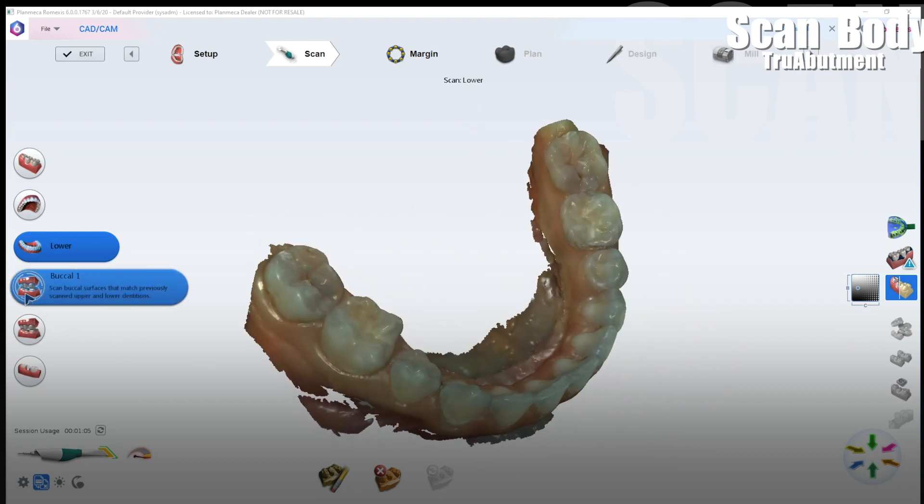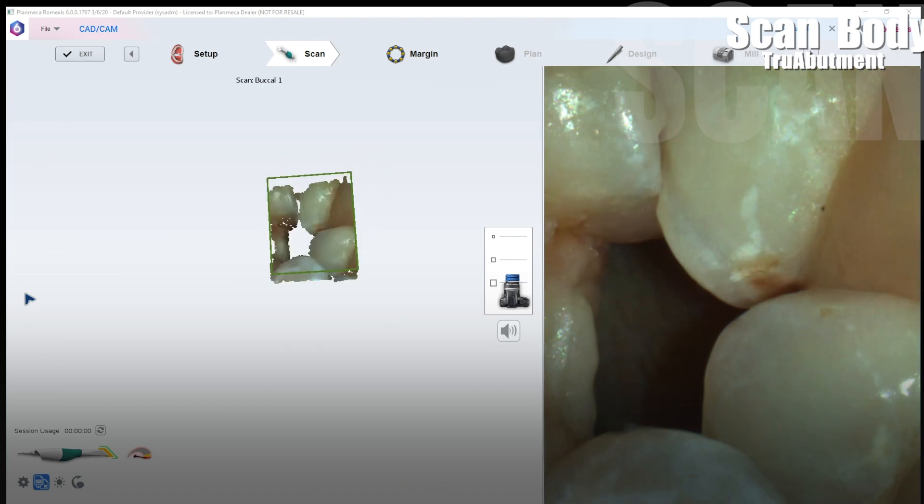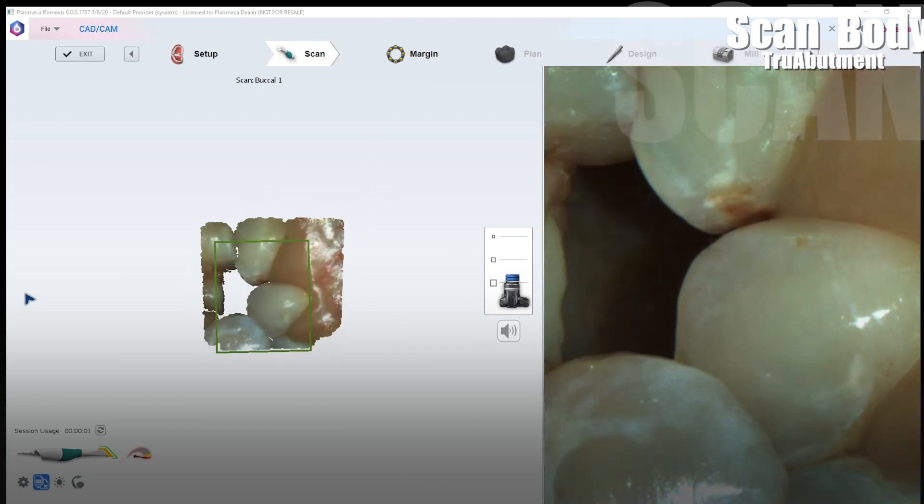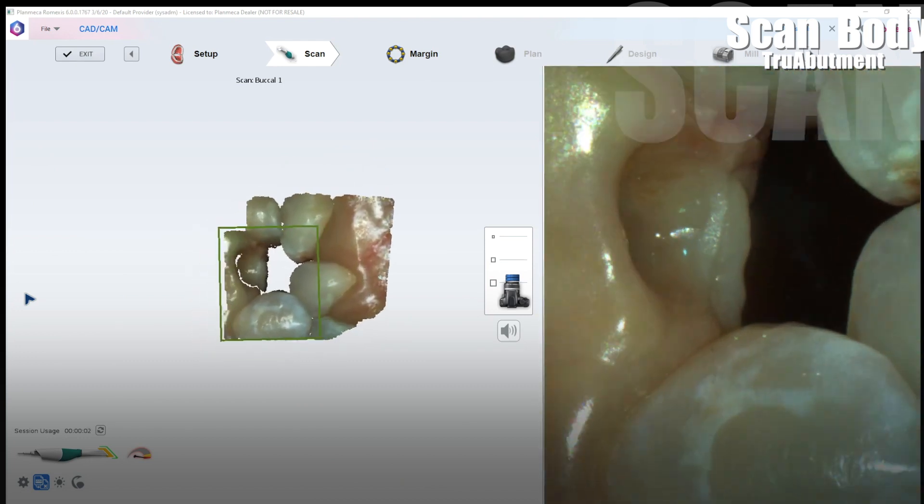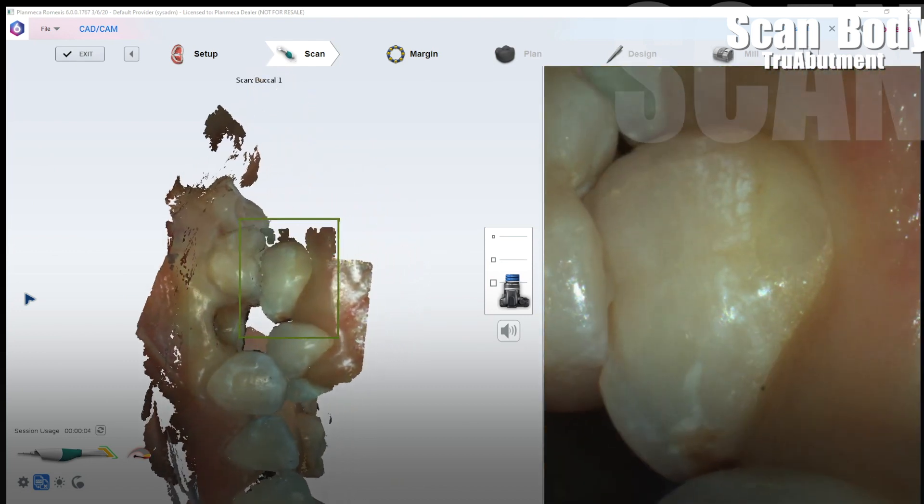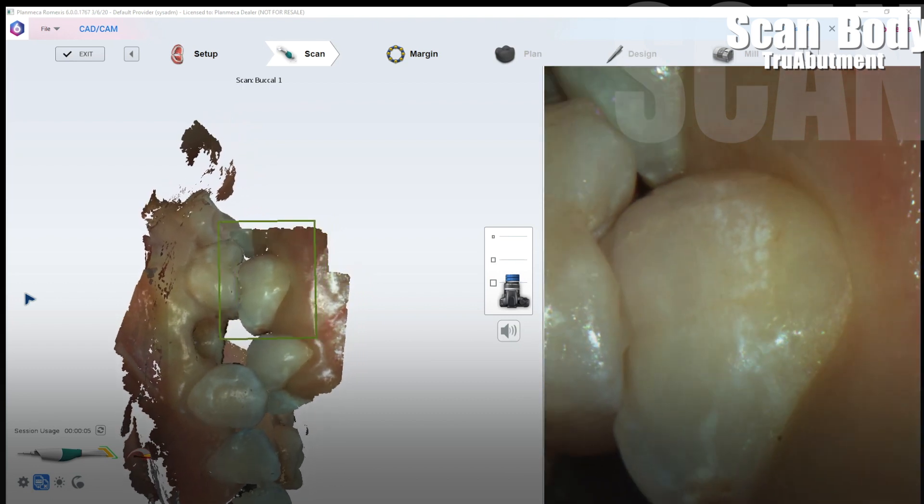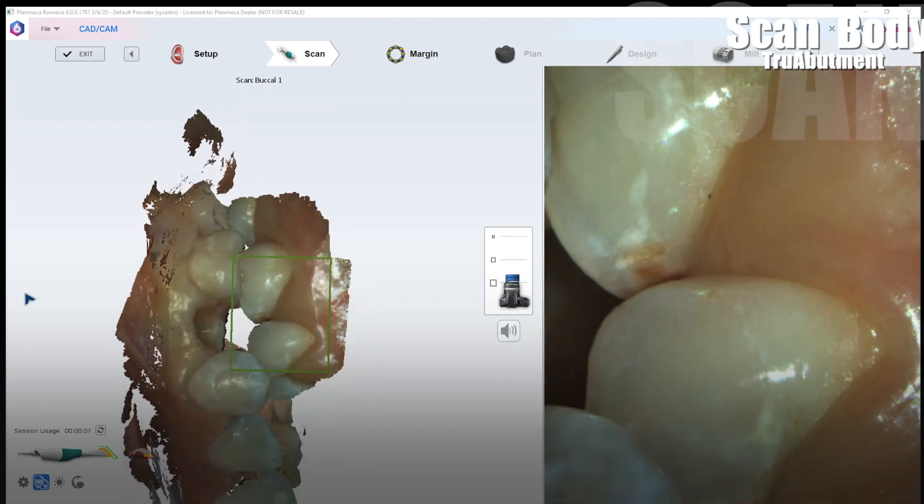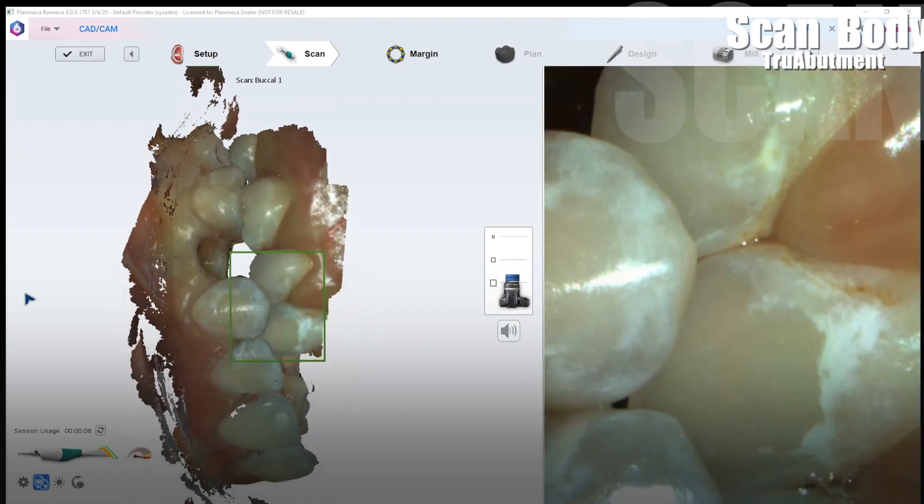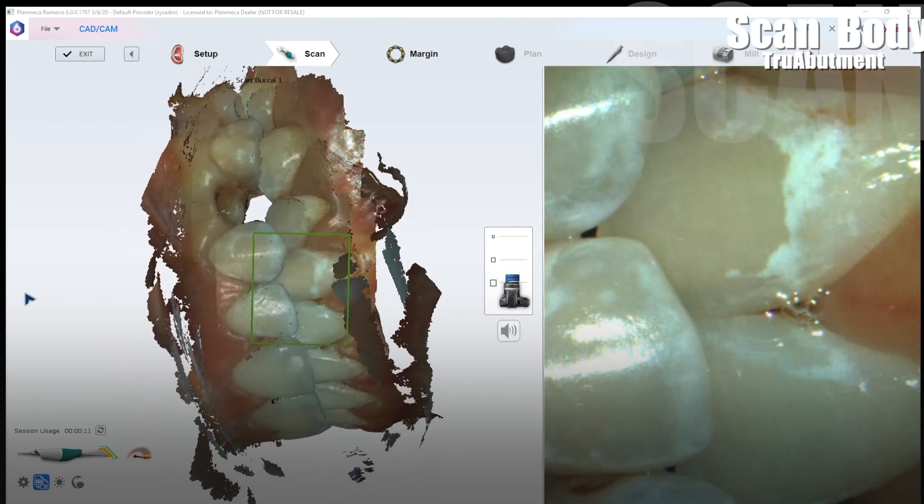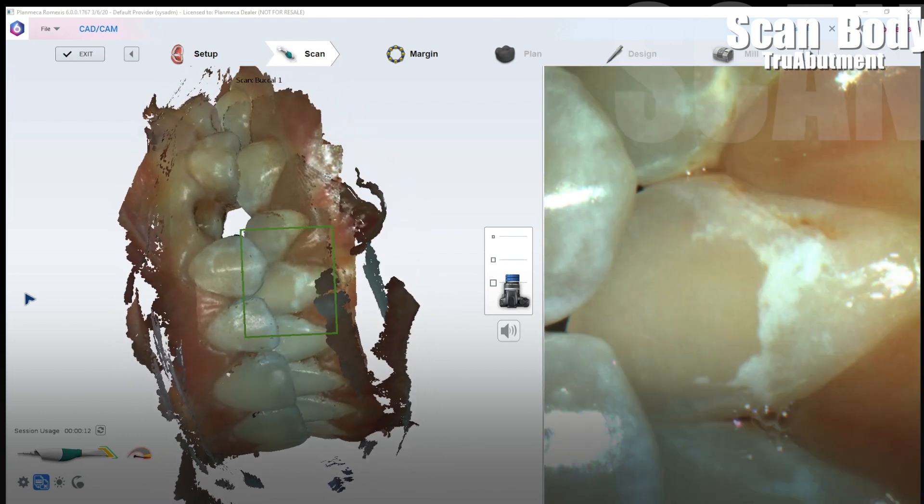I think we're pretty good there. So now let's go ahead and go to our bites. For this case I'm going to do bilateral bite registrations at the same occlusal scheme. So maximum intercuspation patient here. Bite scans are slower scans so you should slow down a little bit.